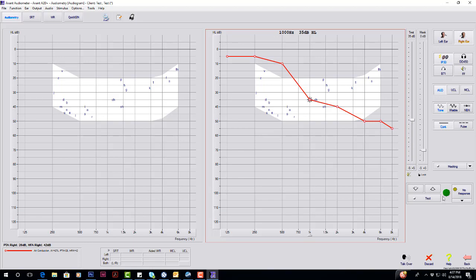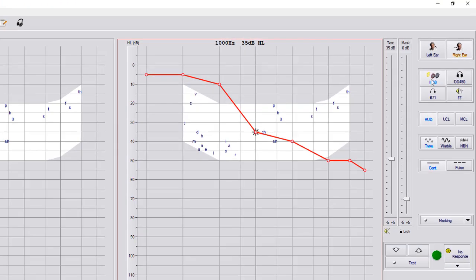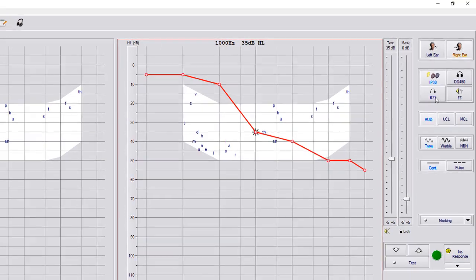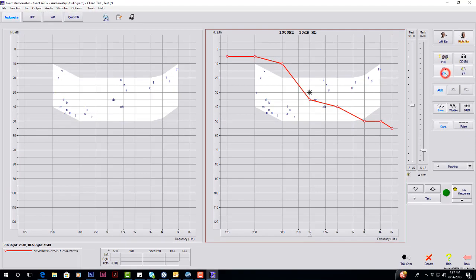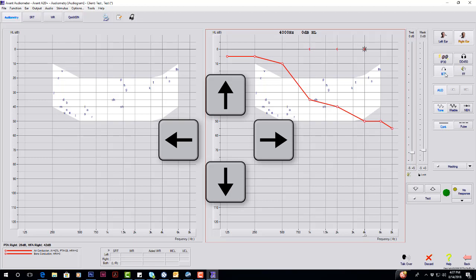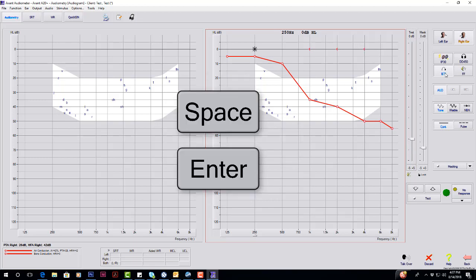Next test is going to be your bone conduction. On the right hand side under your left ear, we have IP30s and the B71. You'll click on B71, and it's the same process as air conduction. You're going to use the up and down, left and right arrow keys, and spacebar or enter to present.